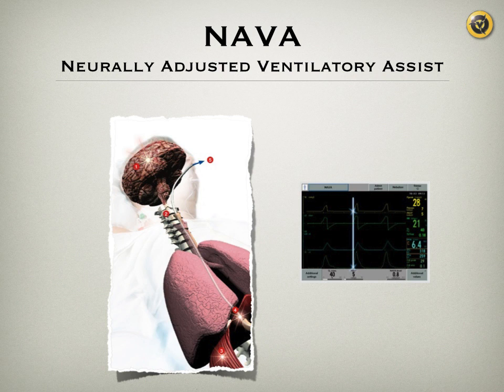But if you look at premature infants, say 500 grams, who are breathing 40, 50 a minute, that's their normal rate, and their total volume is very small, 10 mLs, 8 mLs, 15 mLs. It is very hard for the machine to follow that fast rate at very small flow differences. So you cannot do it.